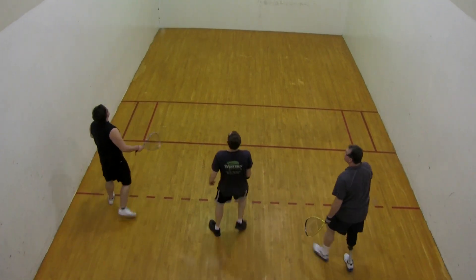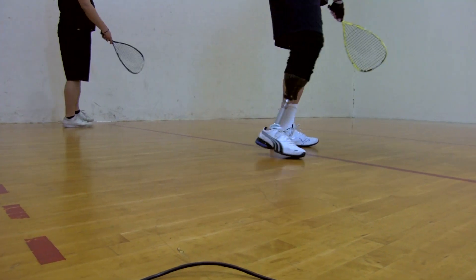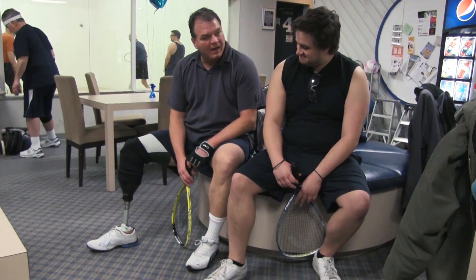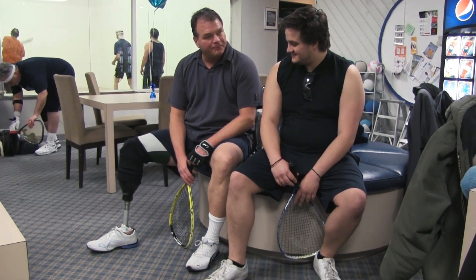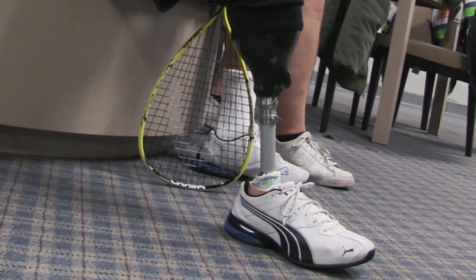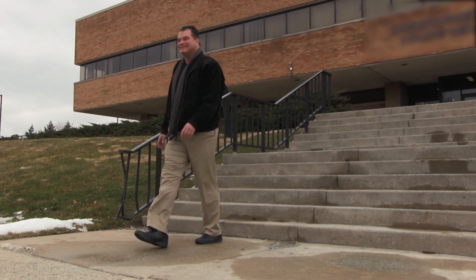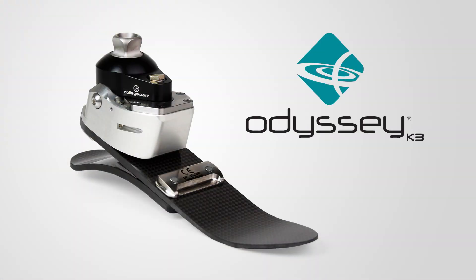The Odyssey K3 is an excellent choice for patients looking for a smooth everyday foot. It will respond in stride during low to moderate activities like walking to the office, hiking on the weekends, or playing a pickup game of racquetball. The hydraulic ankle also allows the foot to lay flat on the floor when sitting for a natural look. Conquer the dynamic curves ahead with the Odyssey K3 from College Park.